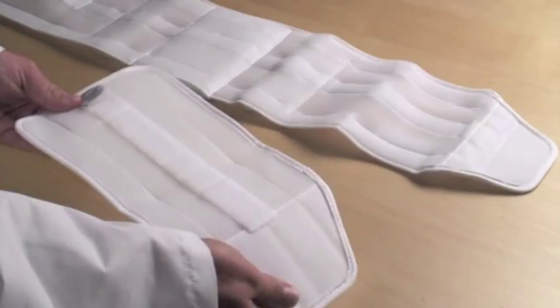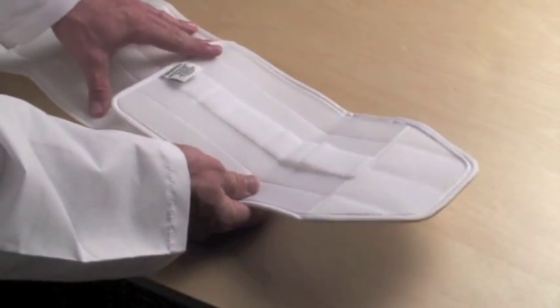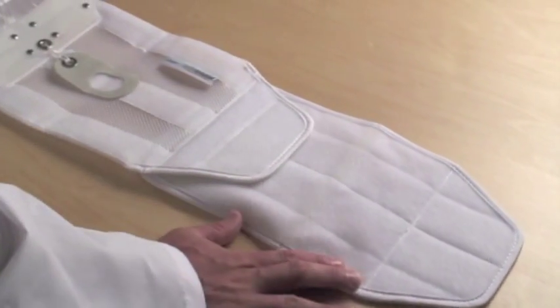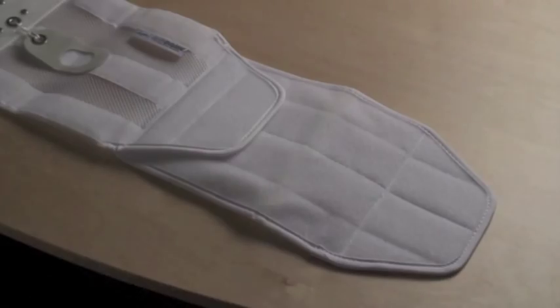The Quickdraw extension panel is designed to fit waist sizes larger than 60 inches. Aspen offers a Quickdraw extension panel. Attach the loop Velcro of the extension panel to the hook Velcro of the right side of the Quickdraw. The extension panel allows for an extra 8 inches in circumference.